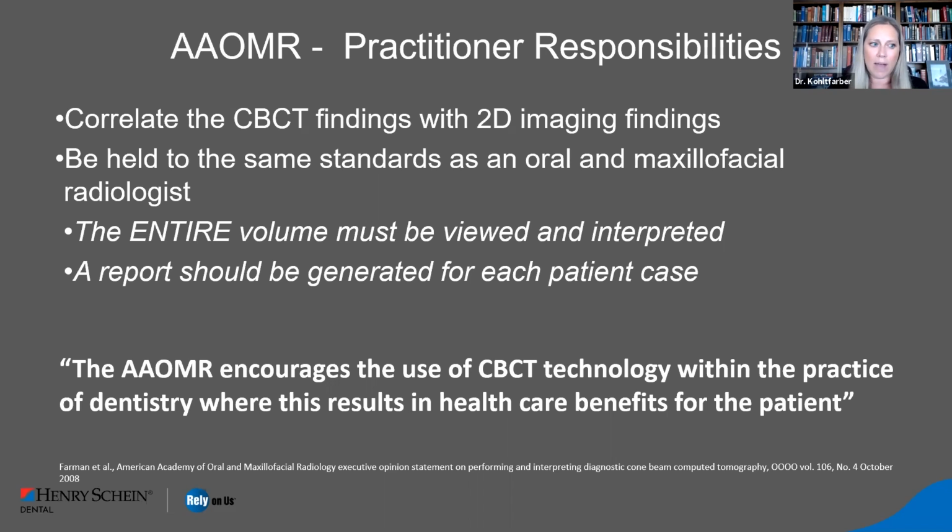Now you might think, how can I get out of that? Maybe that's a little bit too much for me right now. No problem. If you send that scan on to an oral maxillofacial radiologist to read, you have kind of relinquished that liability. You've handed it over to them. You're not responsible for that.